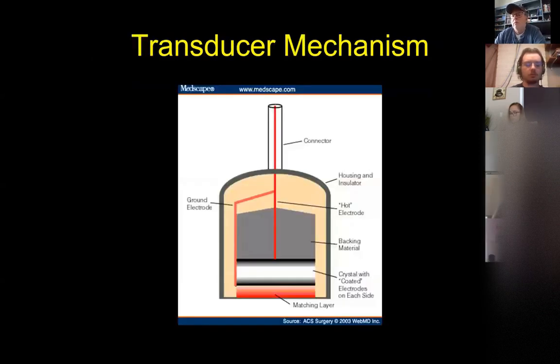Are there specific cutoffs for when you would use each probe, or is that just kind of personal skill and learning through experience? Personal skill and learning, that's a really good question, Kyle, but it's personal skill and learning and trial and error. So a lot of times, if you have a big dog and you're trying to scan their abdomen, I'll start off with a higher frequency probe, and if I just can't penetrate enough, then I'll switch to the lower frequency probe.